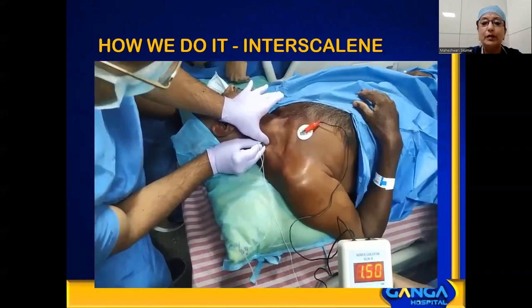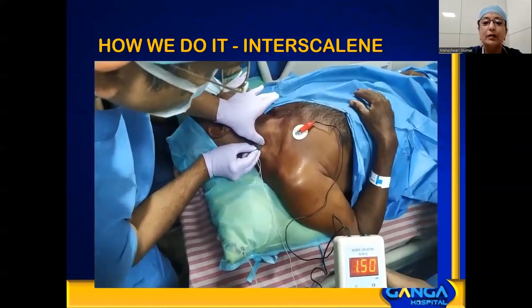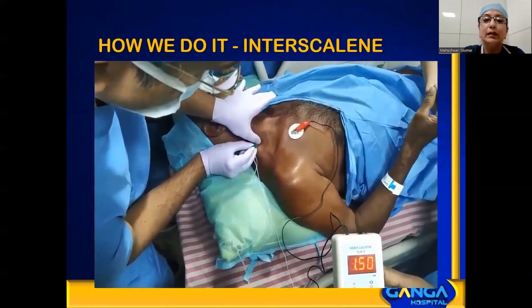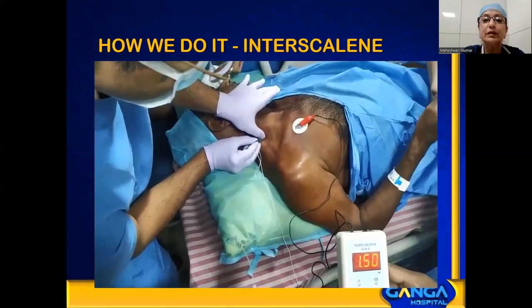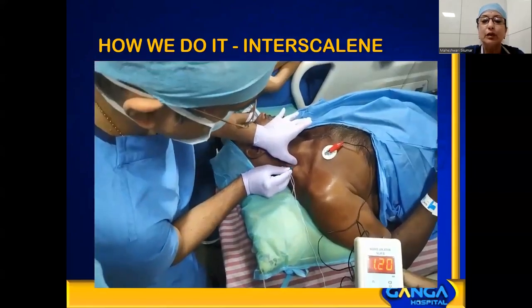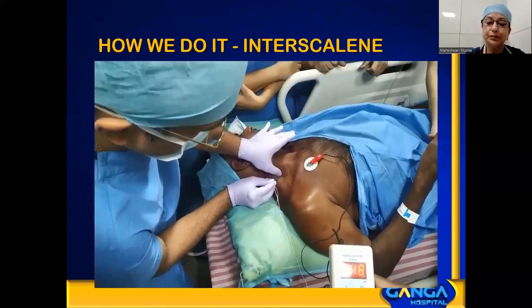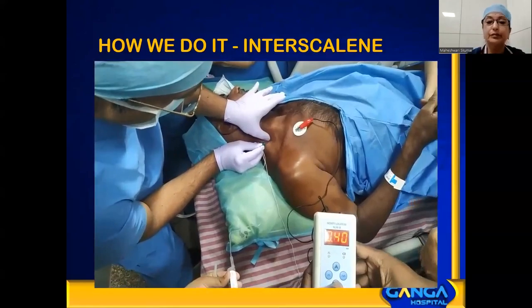Here we are getting a single biceps twitch, so we are not accepting that. If you see, once the needle is inserted a little further down, you are getting pectoralis major and triceps, which is an extension of the arm. So this end motor response is accepted, the current is reduced, and the drug is injected at 0.5 milliamperes of current.